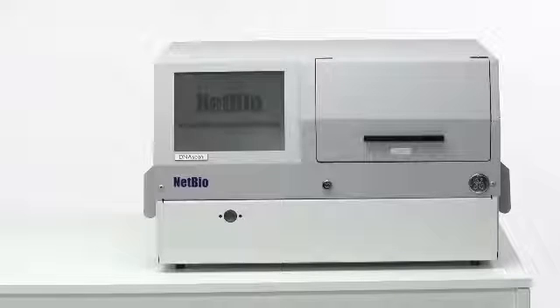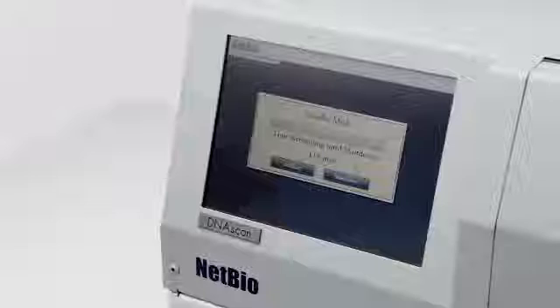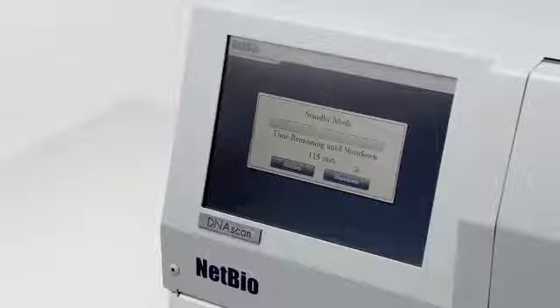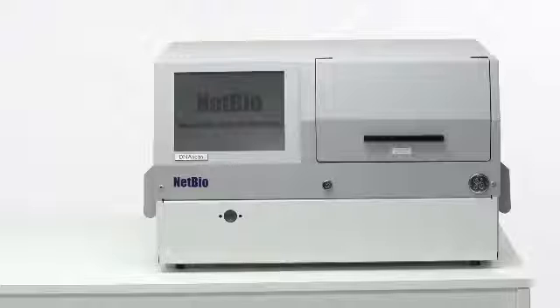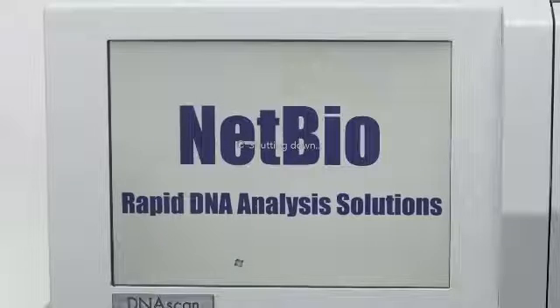If the instrument remains inactive for five minutes, it will automatically go into standby mode. The instrument will remain in standby mode until the user presses either activate or shut down. After 180 minutes of no activity, the instrument will automatically shut down.